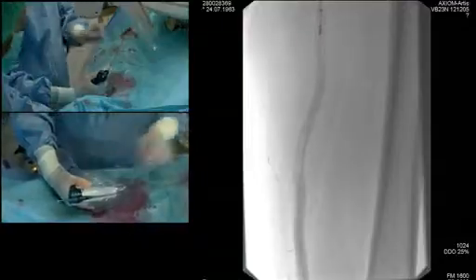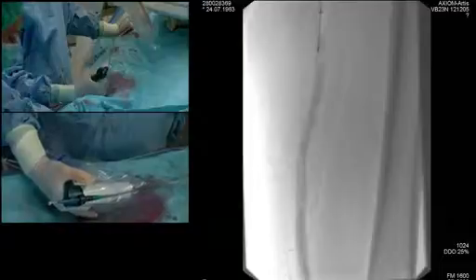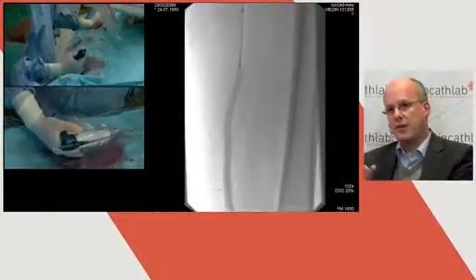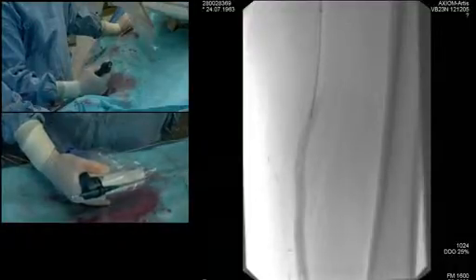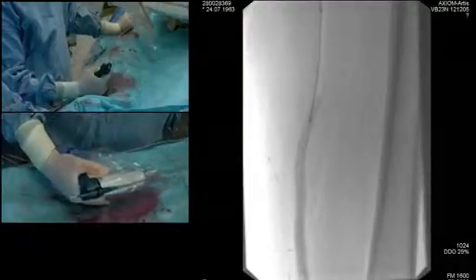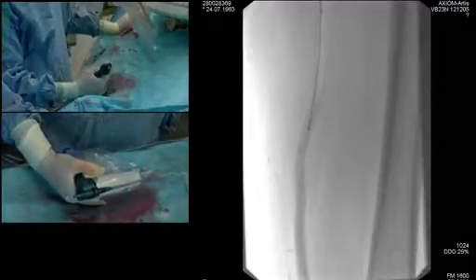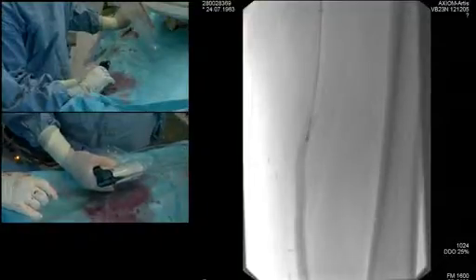We're getting blood here. Okay. Now we can really impressively see how this catheter works. It really sucks out the contrast. What you can see now is the efficacy of this catheter system. We filled this bypass with contrast, and this thrombus filled with contrast is now really detached. Here you can see the removal of the thrombus of the bypass with the Rotarex catheter. So this is highly efficient.